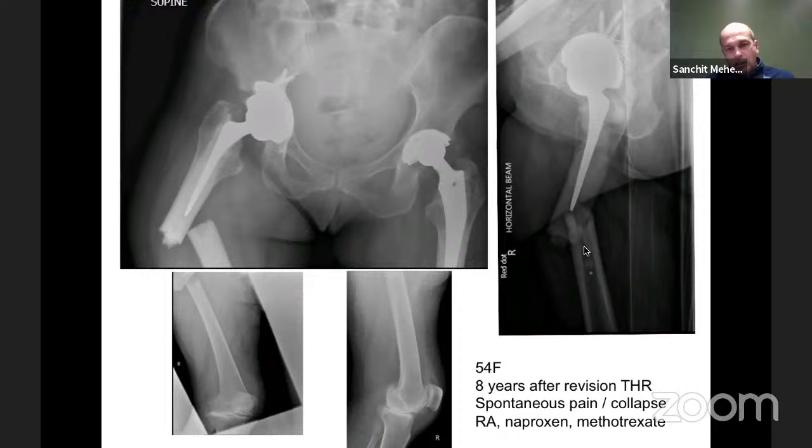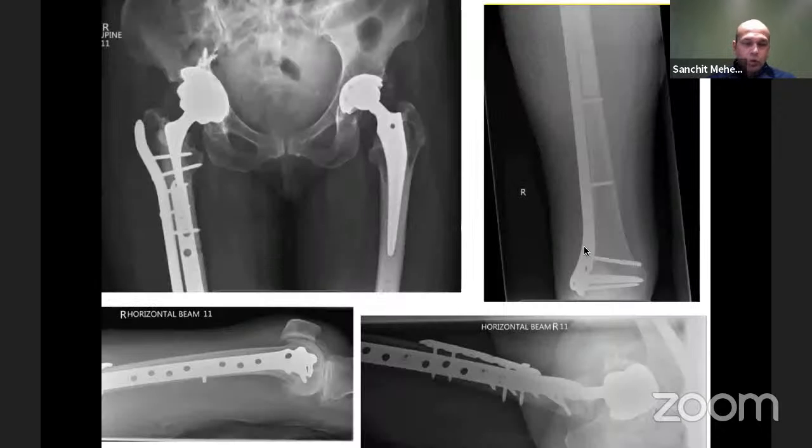Okay? Now, in this case, the implant really looks well fixed, but there is cement distal to it, and the fracture has gone through the cement. In this case, however, we opted to fix it as this patient already had 2 revision surgeries in the past. But this is where I come to the modern fixation devices, that you can fix these fractures, but you have to think about the fixation. So this is one of the Perilock plates that we have used in this scenario, but dual plating.